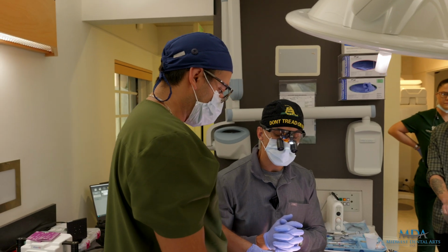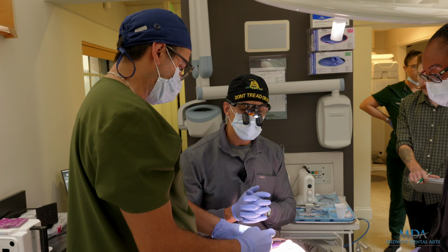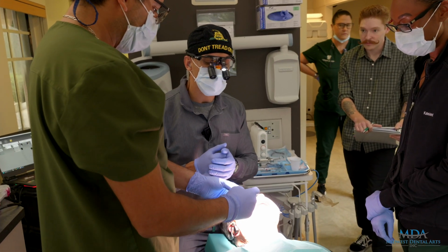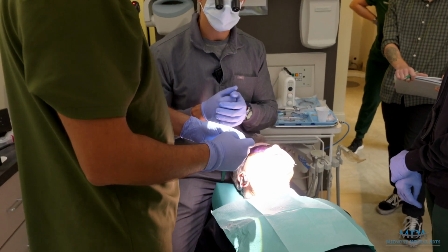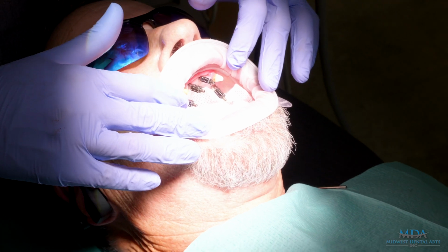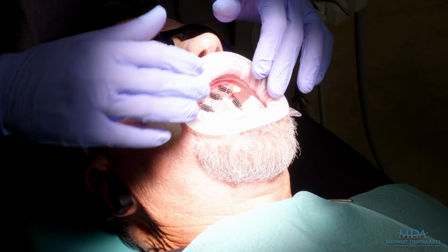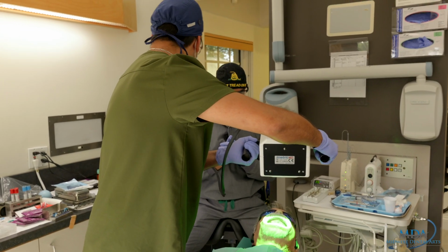We're gonna try to place them always facing us, or kind of like that, so that when I scan, it kind of captures that face. Okay. Yeah, it doesn't really matter because this scanner is really great at doing that. But if we can, it's better. All right, ready, guys? We're gonna go ahead and scan. Open, my friend. Now close a little bit. Right there. Hold it right there.